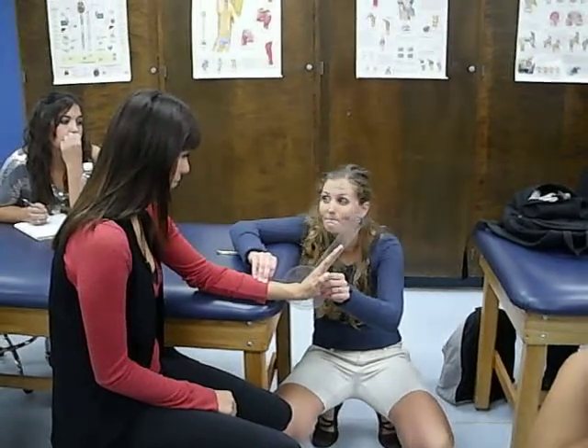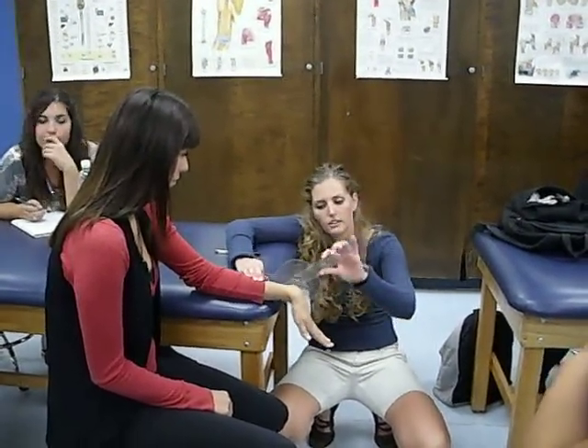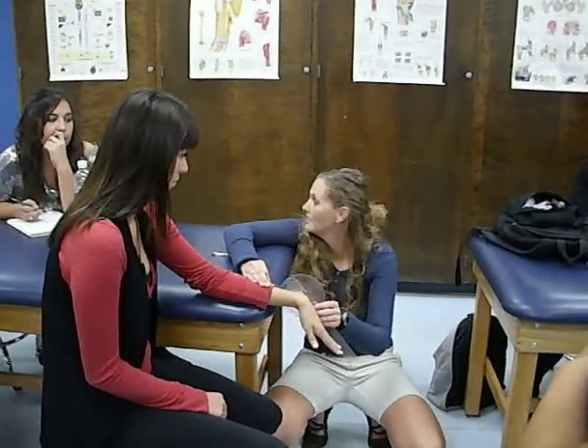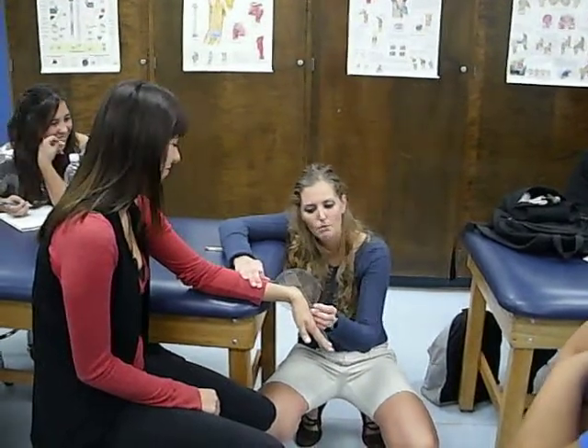What's our norm? 70 — all the way down. Flexion. I'm going to have you come off the fist slightly. 80 degrees is our norm. And then we're going to go parallel with the fist again.